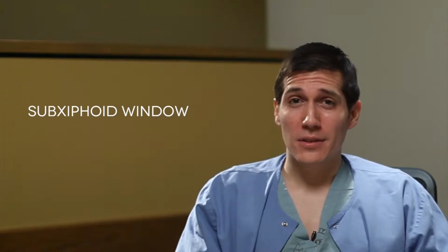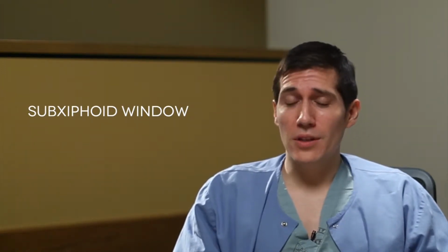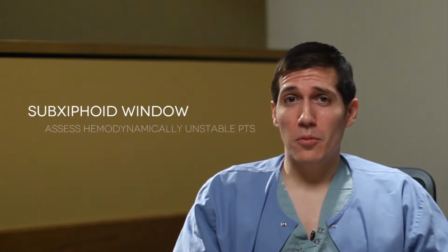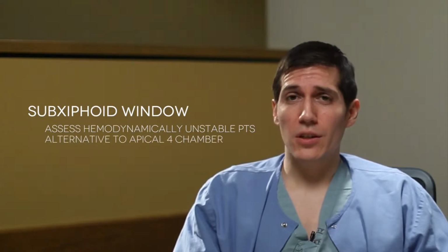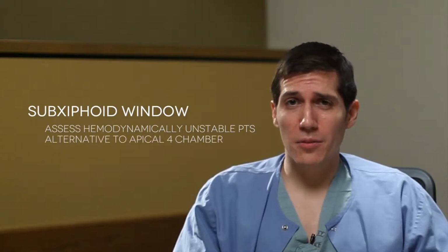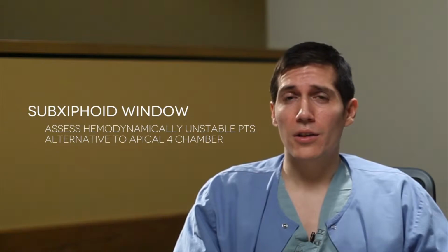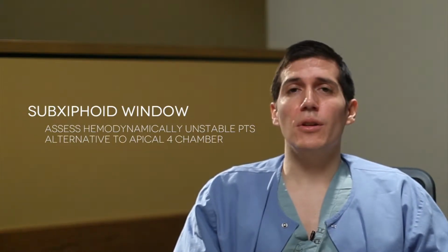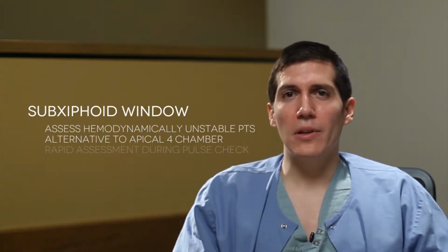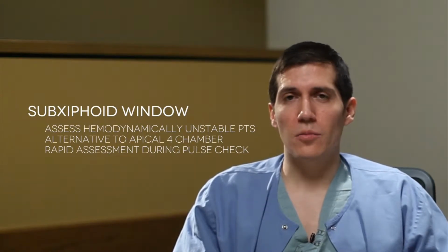Why do we use the subxyphoid window, also known as the subcostal window? Well, we use it to assess hemodynamically unstable patients as an alternative view to the apical four-chamber because you're going to essentially have a very similar view from this window. So in a code situation during CPR, you can actually place your probe and begin to acquire an image so that during a pulse check you will be able to rapidly assess for the etiology of the hemodynamic instability.